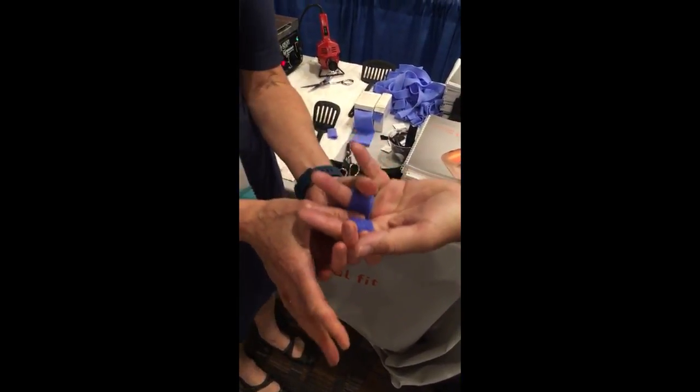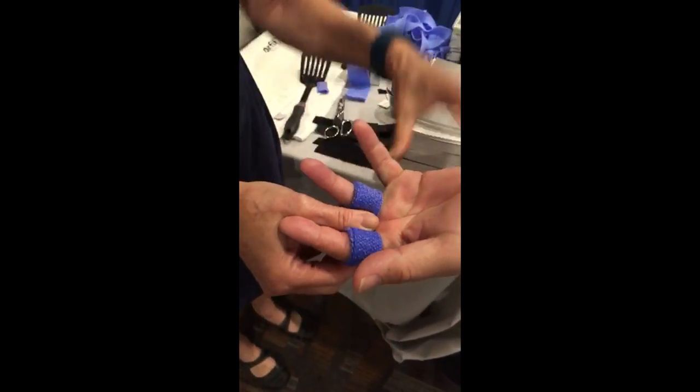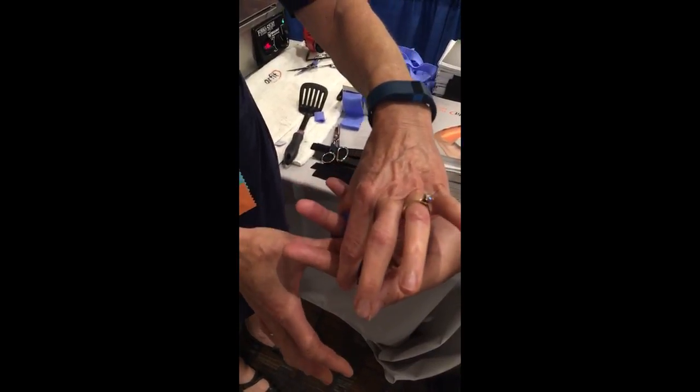You don't have to hold it up like this until it hardens. Let gravity help you. Fabulous. Hold, great tip. I love that tip. To push down and let it harden. And what I'm doing essentially is pushing that middle finger into more extension.